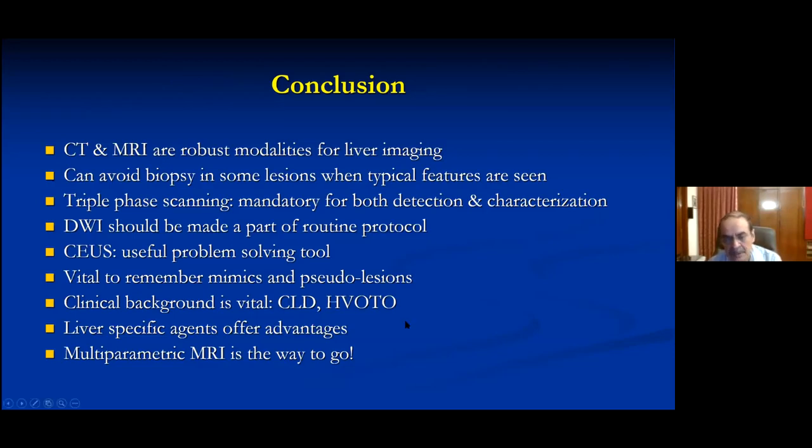Having said that, on MR, what we follow is the concept of eGFR. In those patients who have eGFR of less than 30 ml, we would not inject MR contrast agents. There are some contrast agents which today people say you can use, and these are macrocyclic agents. I'll not go into the details, but remember that there are some emerging contrast agents for MR which can be used even when the renal parameters are deranged.